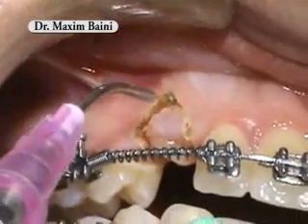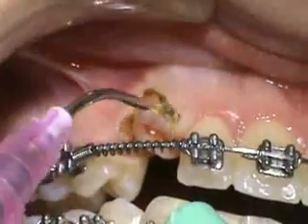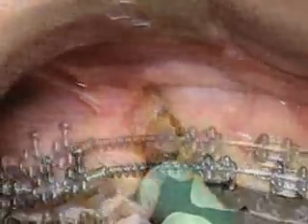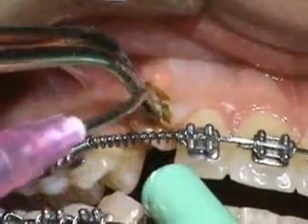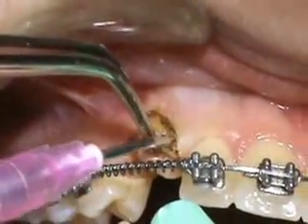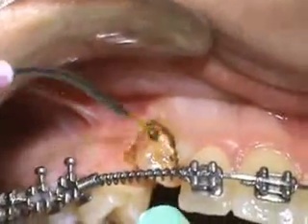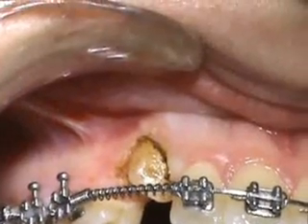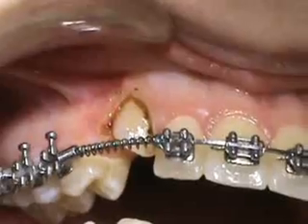When I am using the 15 watt laser in pulse mode it will give me about 2.3 mean power watts. Notice how fast it is. It's better to stretch the tissues when we are performing the cuts using lasers. Now I am finalizing my cut, removing all the excess with the diode laser.